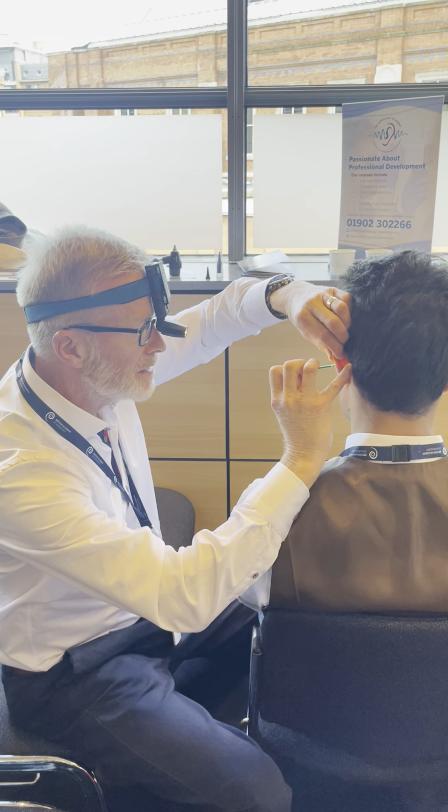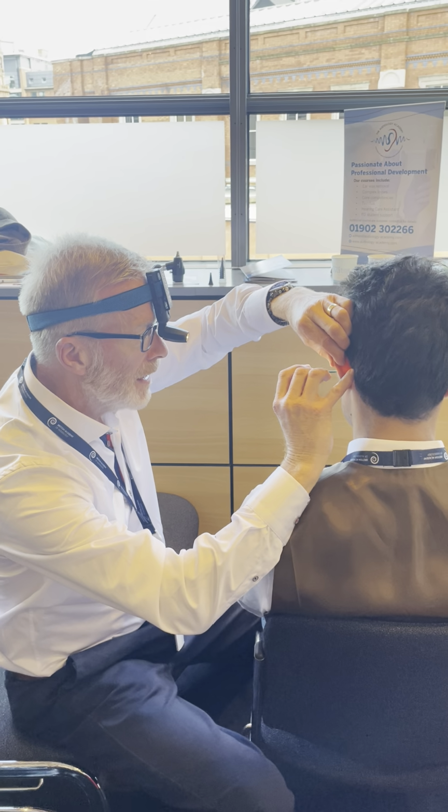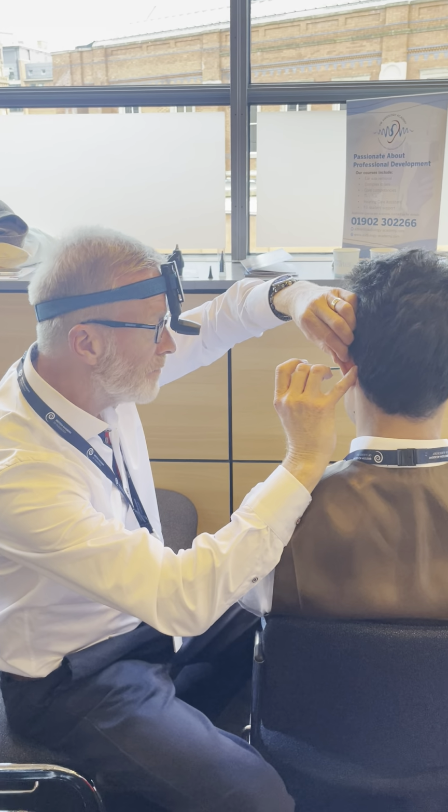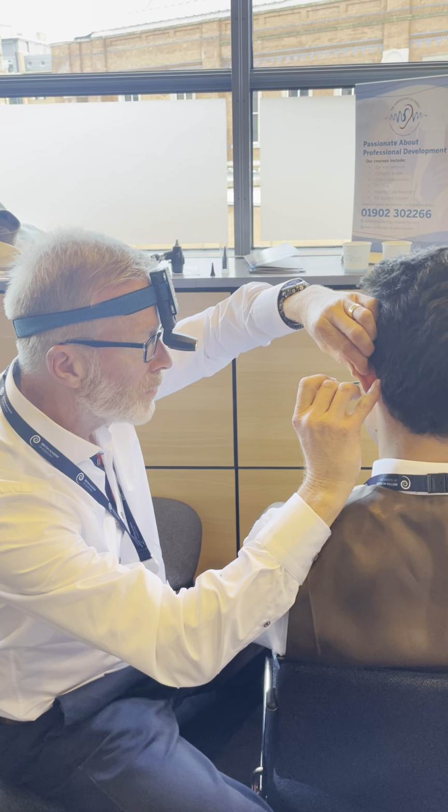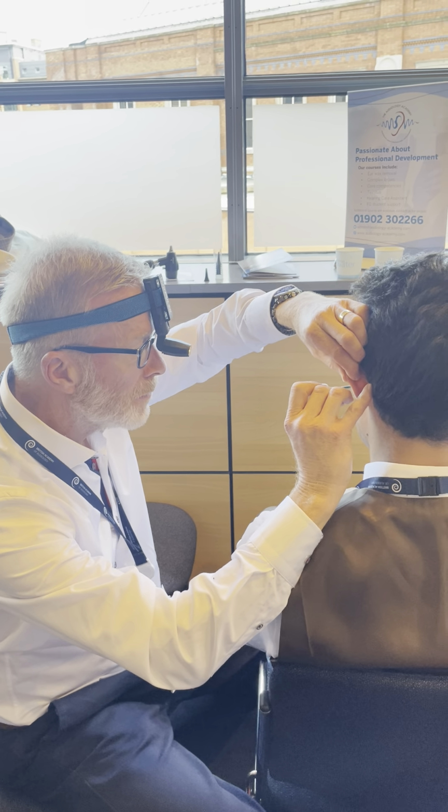There, so I'm just placing this into the ear canal. And again, any discomfort, let me know. Okay, so I'm just very, very gently going into the ear. And we have gone for a slightly larger one, so we are coming up against the canal walls.